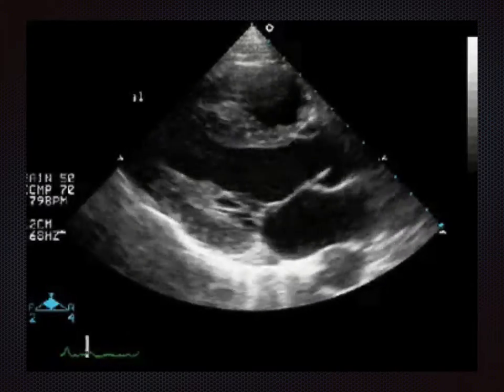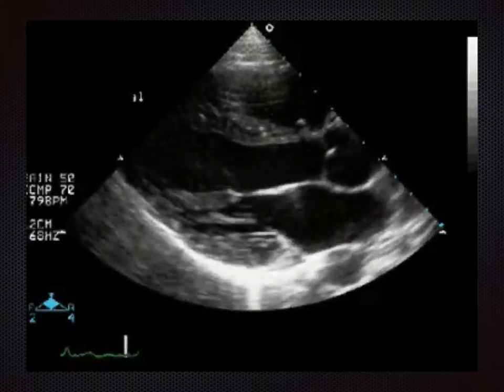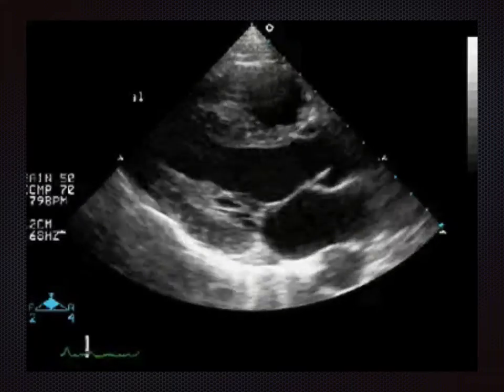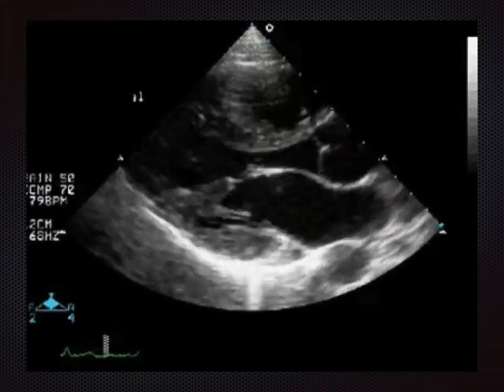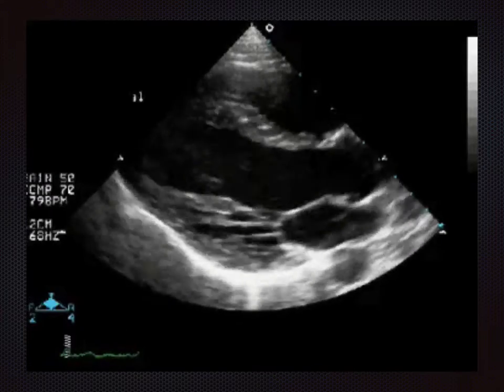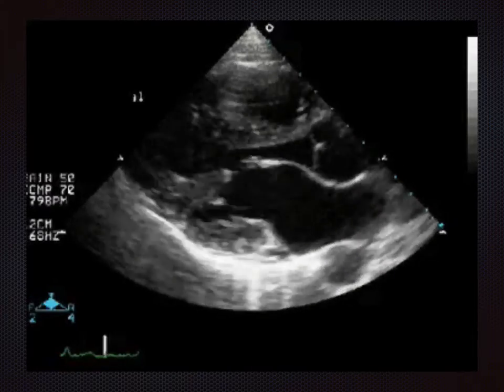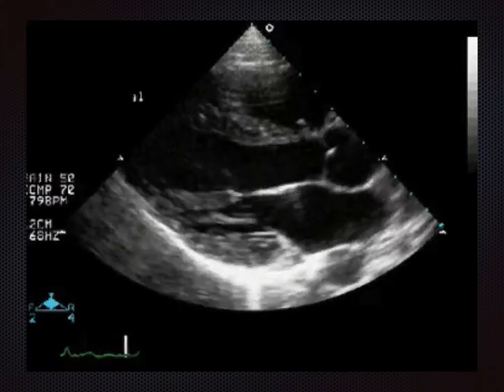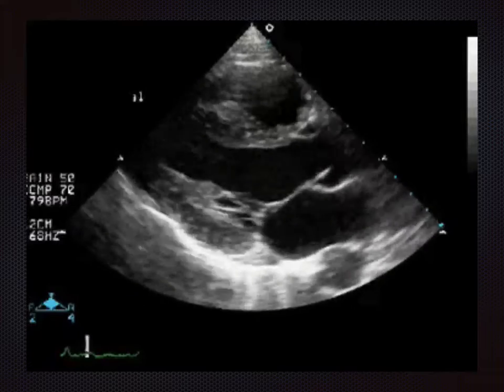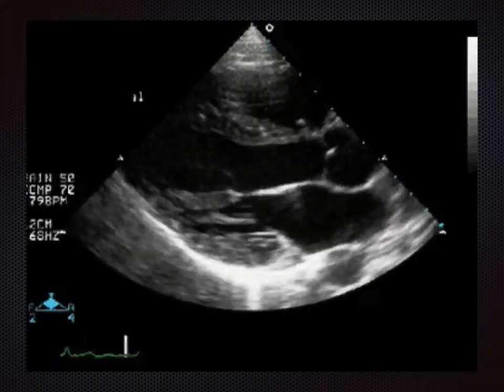So these little dots are spaced at 1 centimetre. If you think about that, in a relaxed state, the myocardium, or the left ventricle, is approximately a centimetre thick before it contracts. So that's what the normal dimensions of the muscles should be in the relaxed state. However, as you can notice, when the systolic phase occurs, the actual wall thickens. So we normally expect a 30 to 40% increase in the thickness of the left ventricular wall during systole.